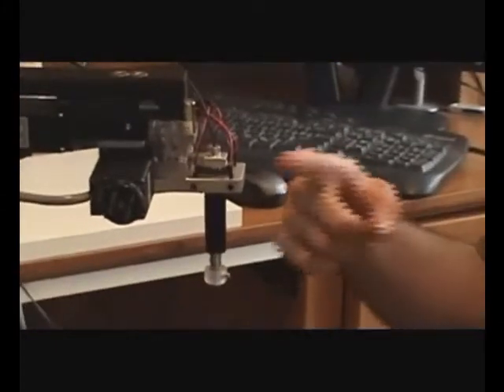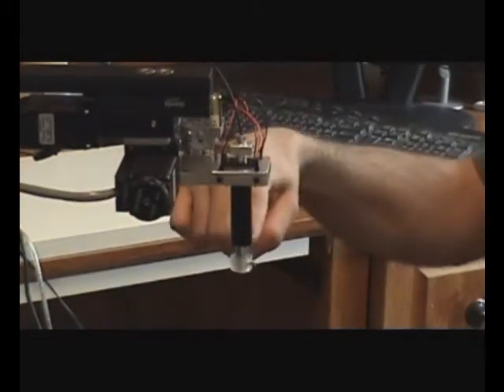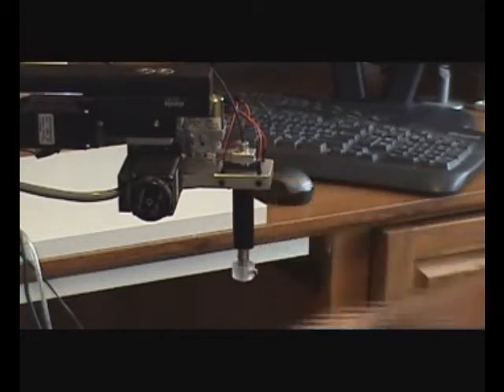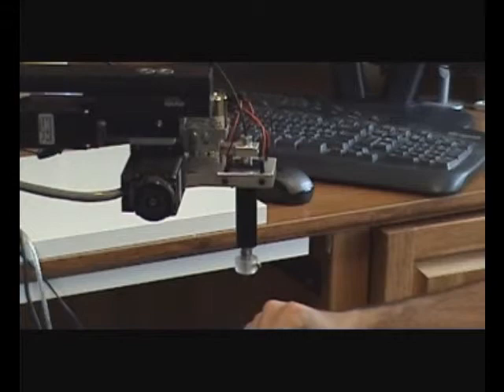Now I do the scanning again. As you can see again, the solenoid initializes itself, it moves much faster. As you can see, when the probe is down, is when the scanning occurs. And this makes the total travel much, much quicker.